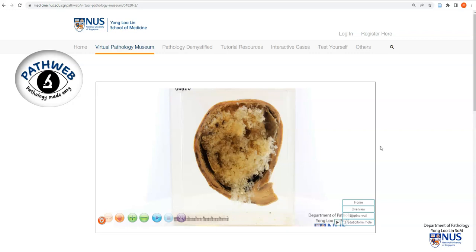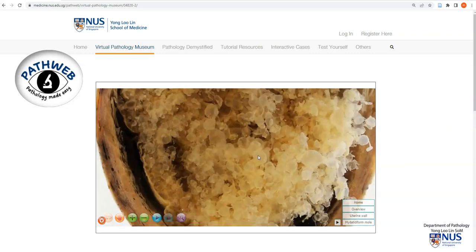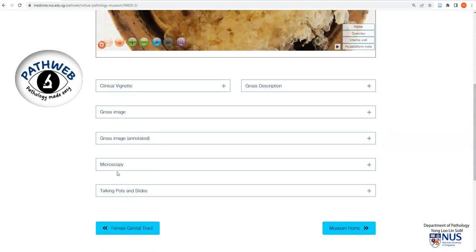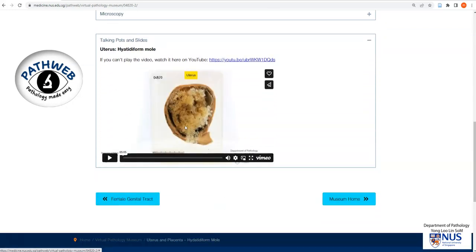Here is a very quick recap of the gross appearance. This is a virtual pathology specimen from the virtual pathology museum on PathWeb. Here is a uterus, and within the uterine cavity we can see a mass that is extremely friable, composed of translucent, grape-like, bubble-like vesicles. Each one of these corresponds to a swollen chorionic villus seen microscopically. The corresponding video on gross features of hydatidiform mole can be found under Talking Pots and Slides, which goes into more detail on the different types of hydatidiform moles.